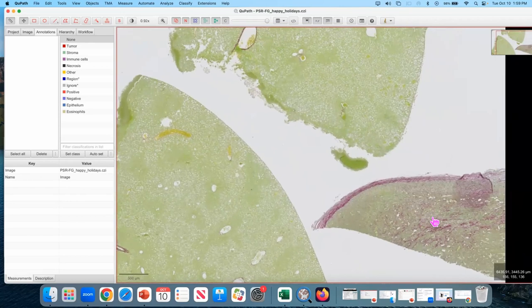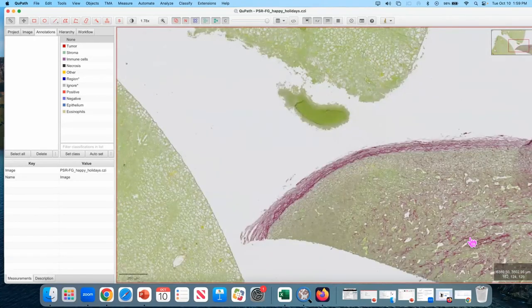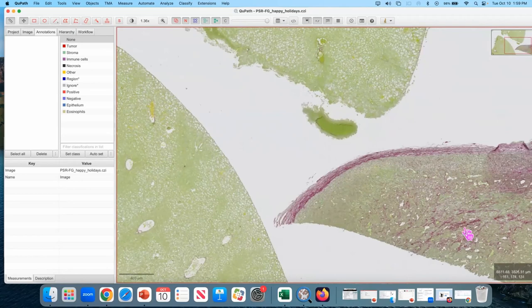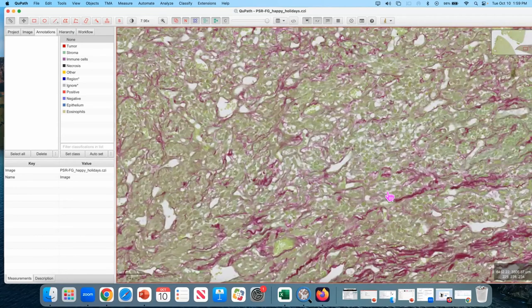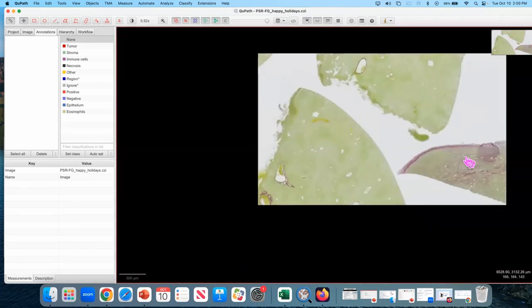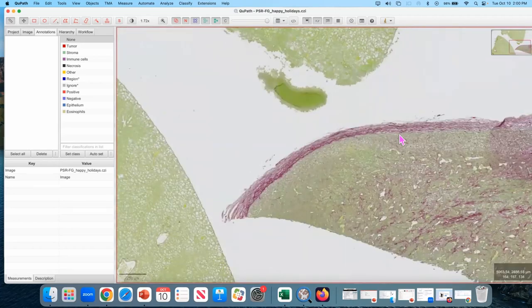So anybody have any thoughts on what this is? I was just looking at it. Sorry, gallbladder? Kidney? Tumor of some sort. I'm quite certain it's not spleen. Gallbladder is very thin. I know maybe you weren't saying that this is gallbladder, but gallbladder would be somewhere in the region, but is not shown on this tissue. So perhaps kidney, but in these cords, there's a lot of erythrocytes. Spleen will look different than this. I thought it was adrenal gland too, but look at the size comparison. Then again, it could be that this is not from the same species as this. Is that possible, Brett? No? It's all mice? It's all mice? Okay. Well, it's something to talk about then.